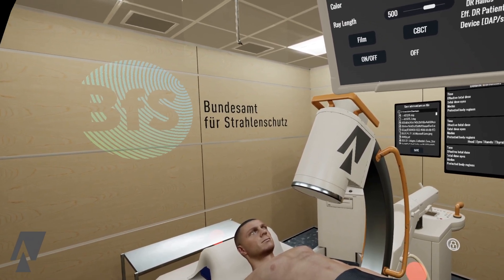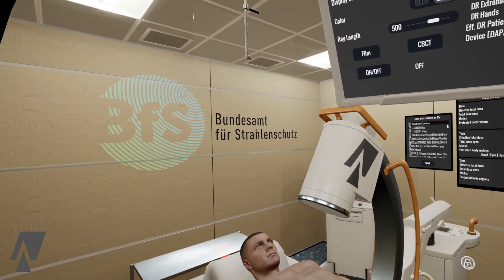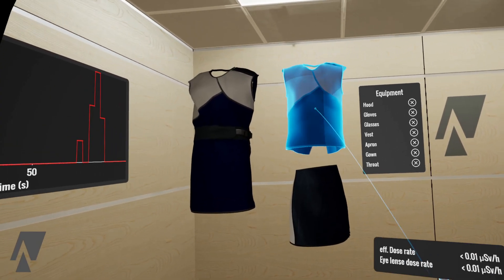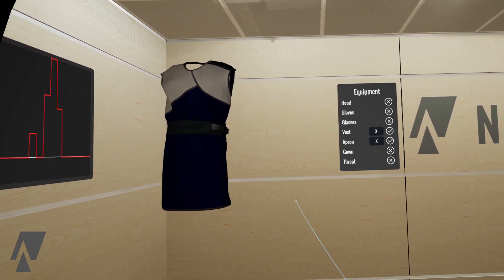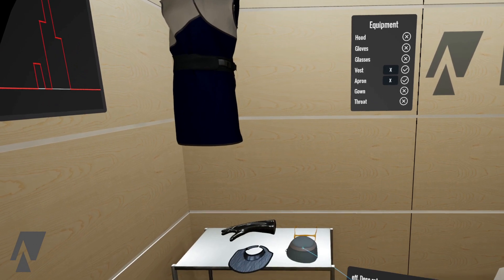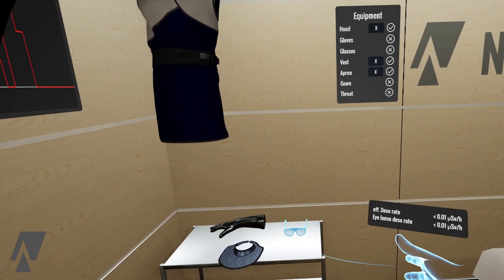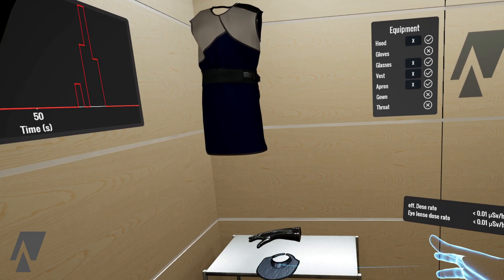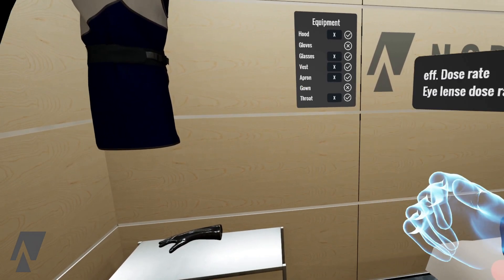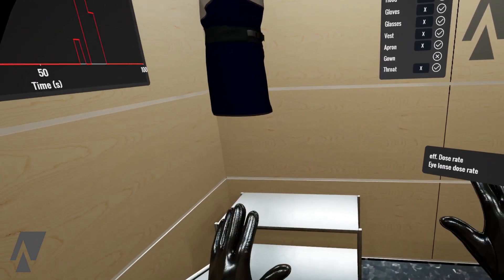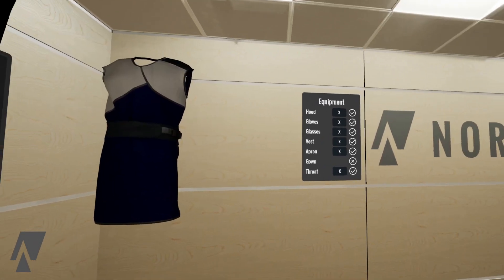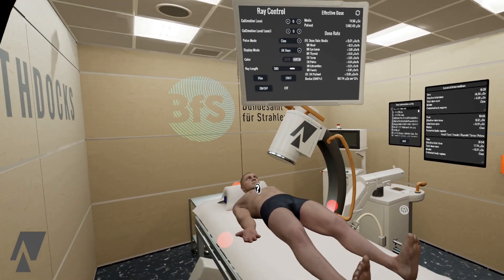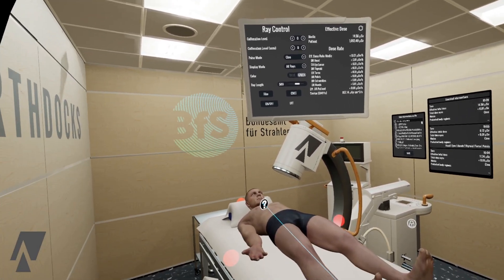Now let's put on some protective equipment, which is located here. And let's try the same thing again, but from a greater distance.